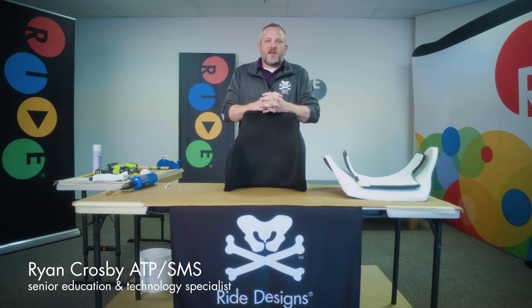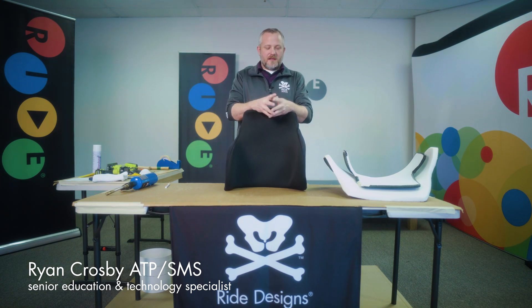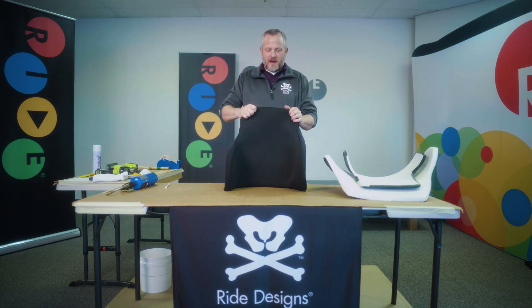Hi, I'm Ryan Crosby, Senior Education and Technology Specialist here at RIDE. I'm going to talk to you today about heating and flaring a lateral support on the RIDE Custom Back 200 — it's our 3D printed back.